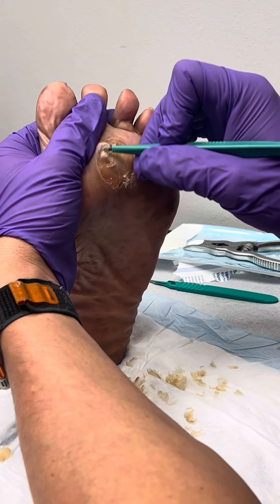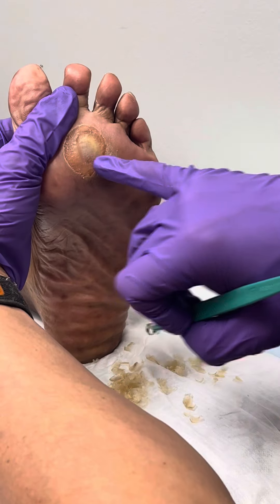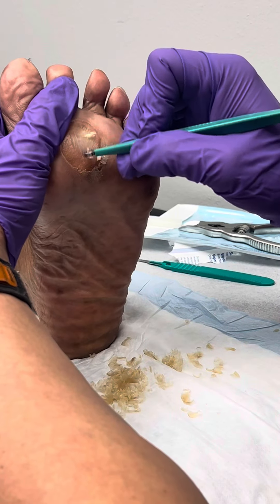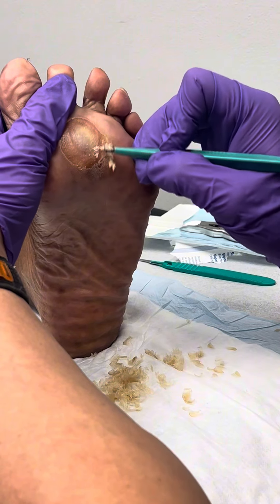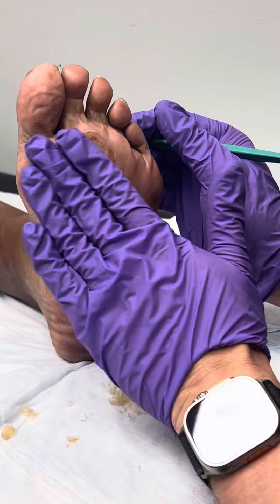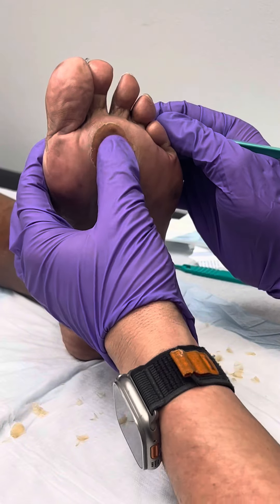You just go around and you can actually see the color change as you get closer to the actual subcutaneous tissue and the dermis, just working those areas until we start to see that color change. And that's about it — you can now see that the whole bottom of the foot is smooth and one even surface, whereas before it was really pronounced.